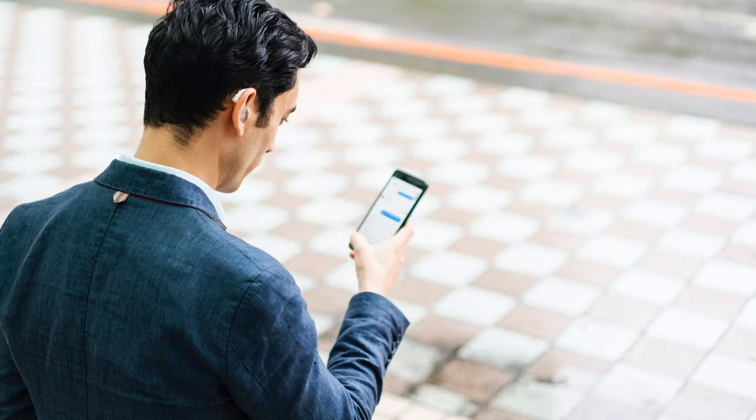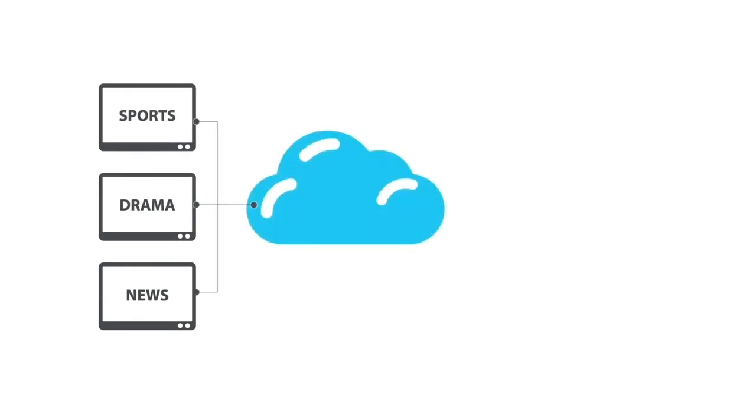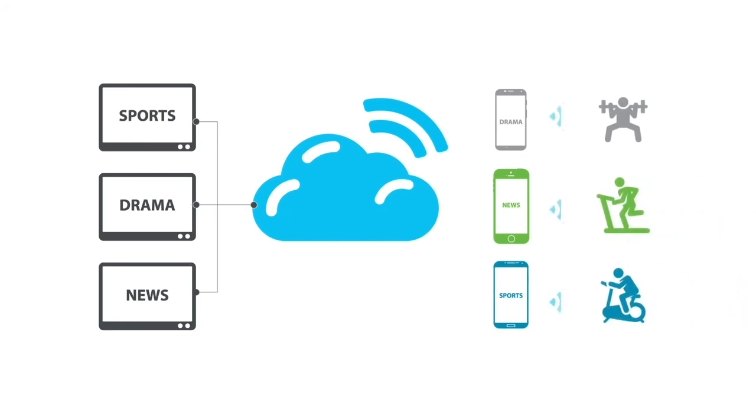Streaming audio over Wi-Fi is the latest technology that can be used for a compliant assistive listening system, exceeding the minimum standards for performance defined in the ADA law. Wi-Fi systems allow users to connect regardless of how far they are from a speaker, using their own device or smartphone or tablet, or one that's provided to them. The audio can be delivered to Bluetooth-enabled hearing aids or cochlear implants through their own cell phone.